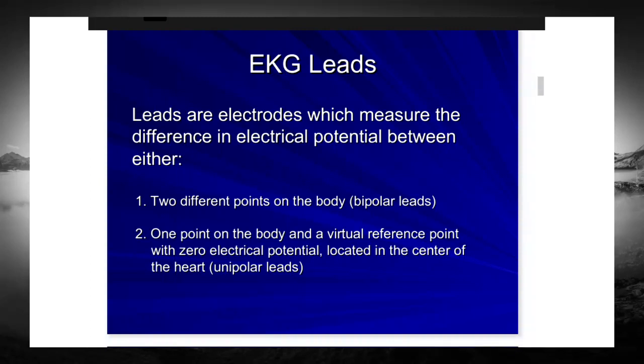All right. So it's important to know, because I'll tell you once we get into rotations, people forget that. It's not 12 stickers that you're putting on. You're actually putting on 10. And actually only 9 of those stickers are actually bringing about information. One of them is what we call a grounding lead. So when we have electricity, we always have to ground it. And so we have to have one of those as well.